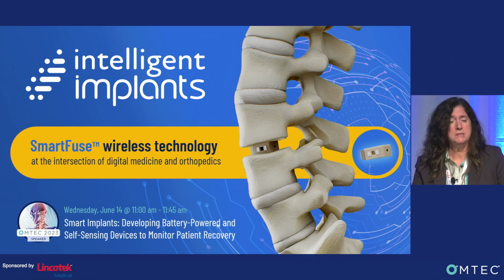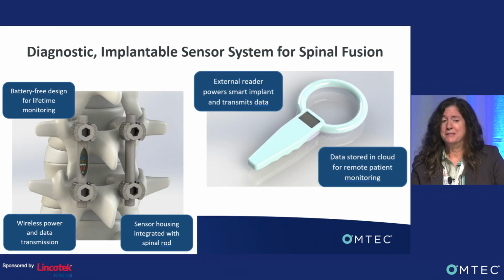Secondly, I'm using wireless power and data transmission as well. Everything is integrated into a housing that's hermetically sealed, and it's external to the rod itself. So I don't want to change the mechanical integrity of the rod, so it's added to that.